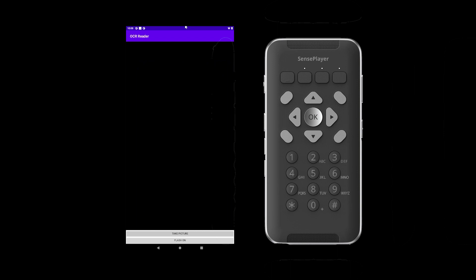The Sense Player offers various OCR features located in the OCR settings submenu. To access the submenu, simply press the menu button. You can scroll to scanning options by pressing the down arrow three times, then open scanning options by pressing OK.